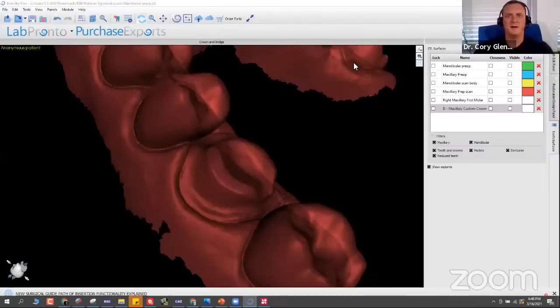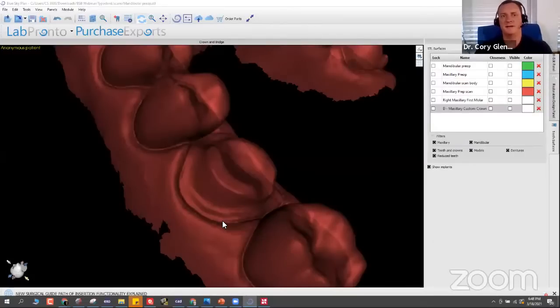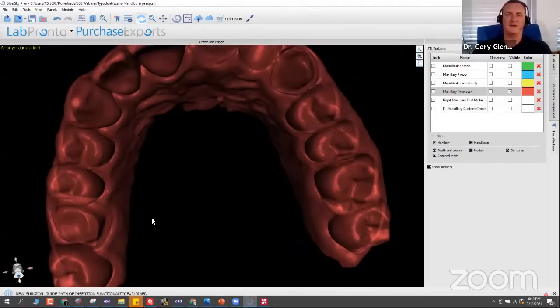Are those all answered now, Michael, or was there more? There's another question about the thickness of the crowns. When adding thickness to the crown, what prevents having a high spot in occlusion? And connected to that, somebody else asked, how do you control the final restoration thickness? Yeah, so you've got a minimal thickness parameter in the design, which I'll show on this next one. So anywhere that it's not thick enough, you're going to see a big red spot shining through, and you can force the software to maintain that minimum thickness.